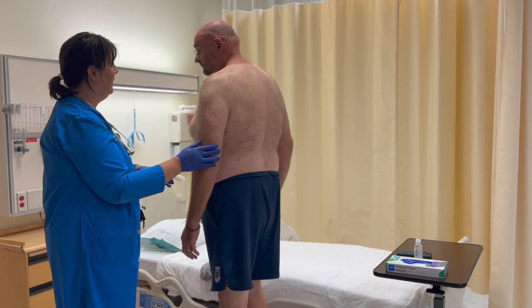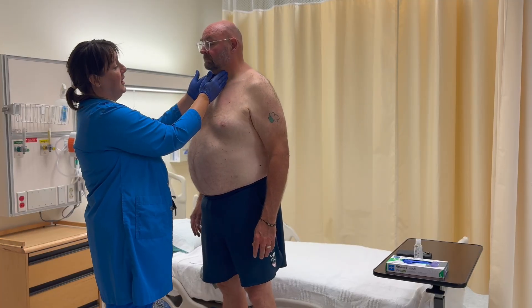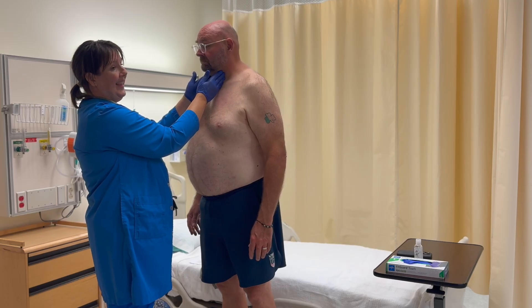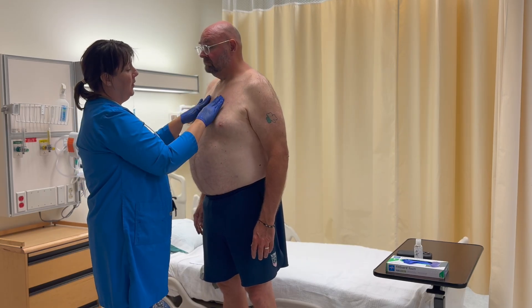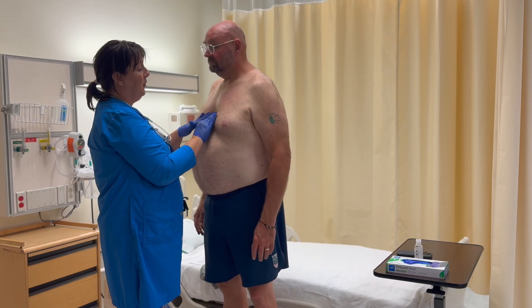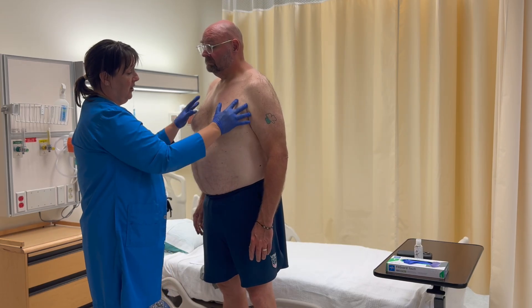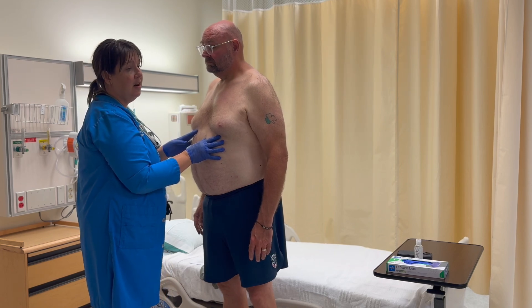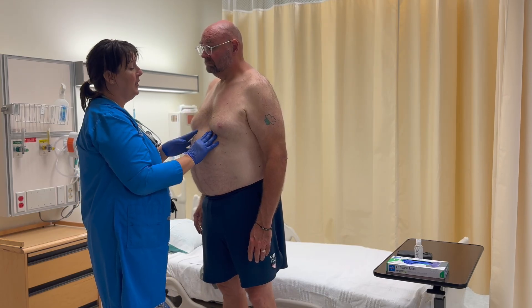On the front, in the tracheal area, we're going to hear bronchial sounds, which are high-pitched, loud, harsh, and tubular. In this area here we're going to hear bronchovesicular — again, those are mixed, moderate pitch. And then in the periphery, this is where you're going to hear your vesicular sounds, which are low-pitched and soft, like the wind through the leaves.